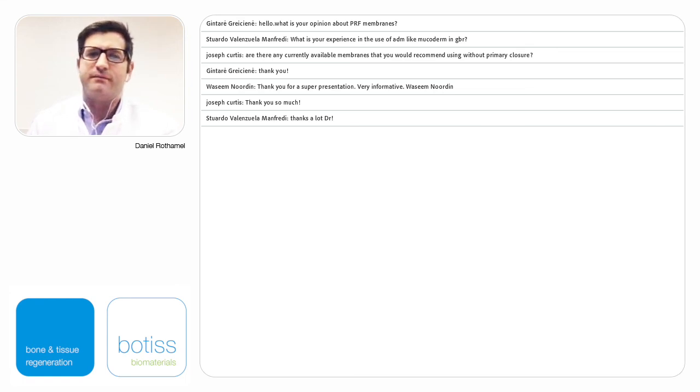And we have another situation for the soft tissue thickening. So when we are using it at implant uncovering, for example, we're using a split flap. So we are using a mucosa flap, and the mucoderm is placed in between the periosteum and the mucosa. So we see much nicer prerequisites for soft tissue thickening than in the situation where we are using it instead of a GBR membrane to separate the soft tissue from the hard tissue.